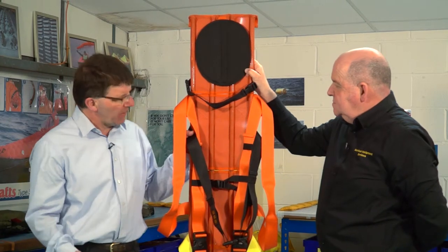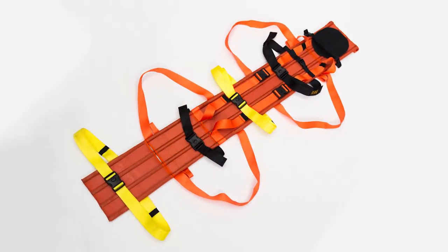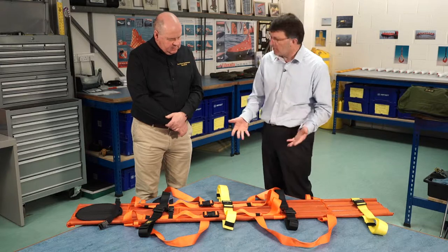So we're going to go over to a table now, and you're going to describe some of the features to me. We've got the stretcher out on the table now, Del, so before you talk me through some of these straps and things, tell me what it's made of.